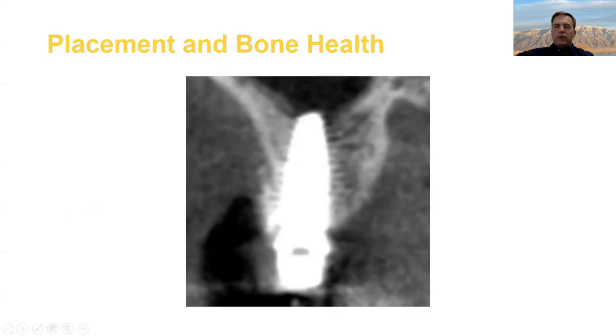In implant placement, as you guys know, heat kills bone. The bone must be kept below 116 degrees Fahrenheit during placement, or you can have widespread bony necrosis. We want to use very sharp progressive drills. Most drills have a life on them. They'll say do 10 or whatever, so we'll want to keep track of that and replace them. In general, it's less of a concern during guided surgery because you're running the drill so rapidly that you're not in contact with the bone for a long time to generate heat. I think this is not something that's a huge problem because we know what it is. We use irrigation, stuff like that, but it's just something to keep in mind.